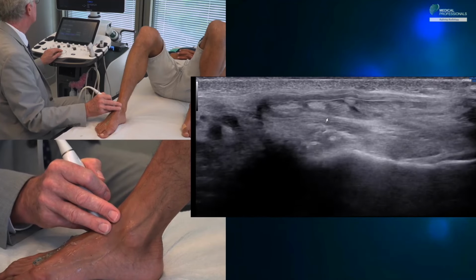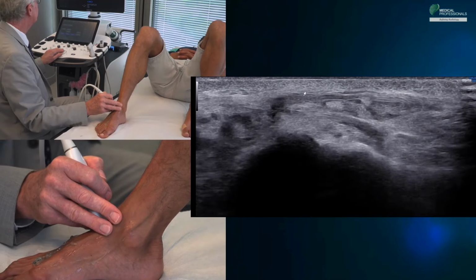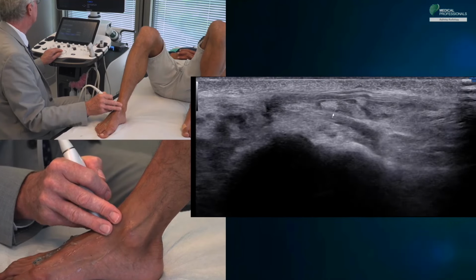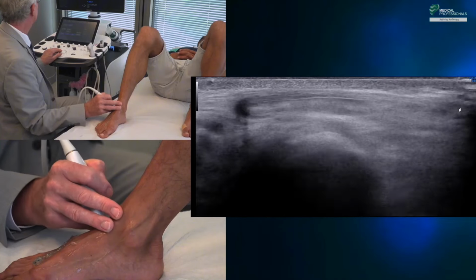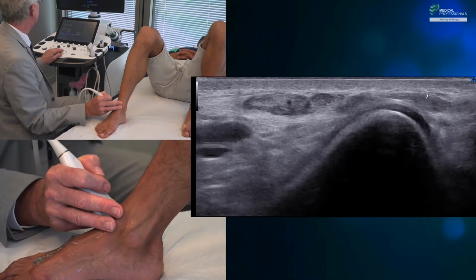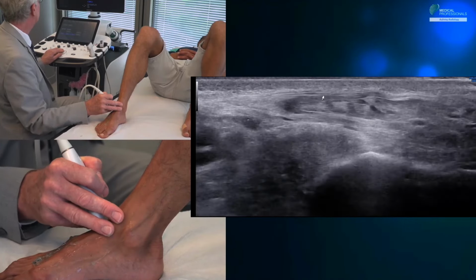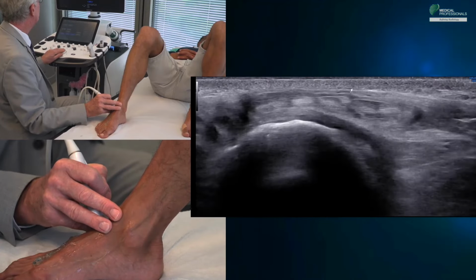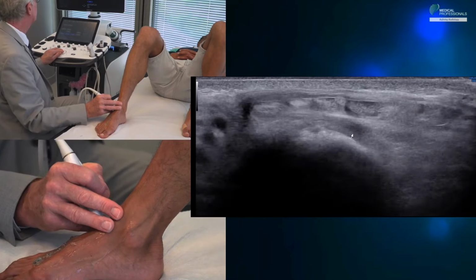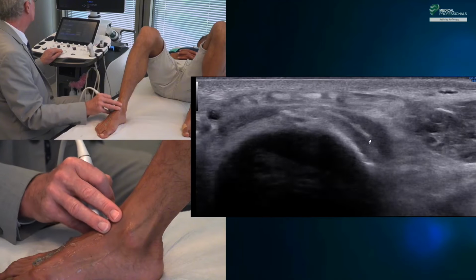We go back slowly to show another structure. We are here at the level of the tarsus and no longer of the leg. Here we find the inferior extensor retinaculum, which surrounds the extensor digitorum longus. It sometimes inserts into the lateral malleolus. If we go up, it merges with the superior retinaculum, but the inferior one is inserted at the location of the sinus tarsi by surrounding the extensor tendon like a sling. Then it literally plunges into the sinus tarsi where it will insert.